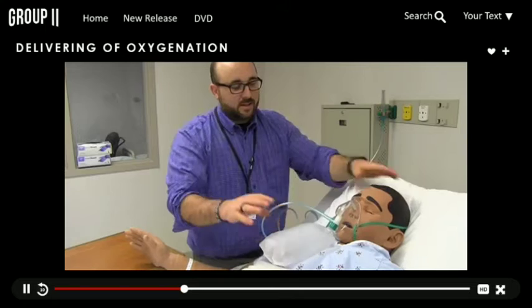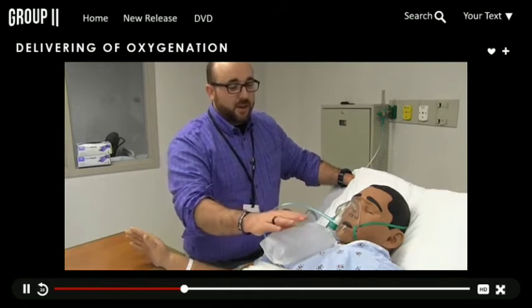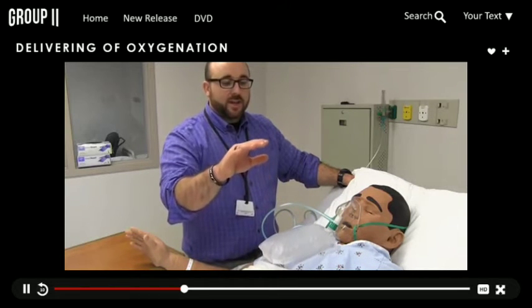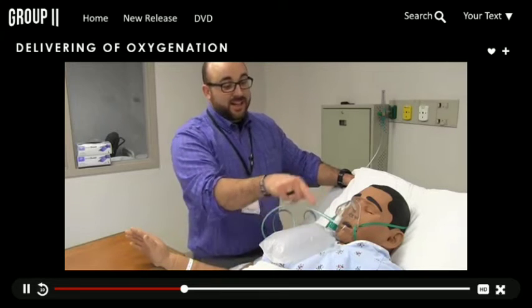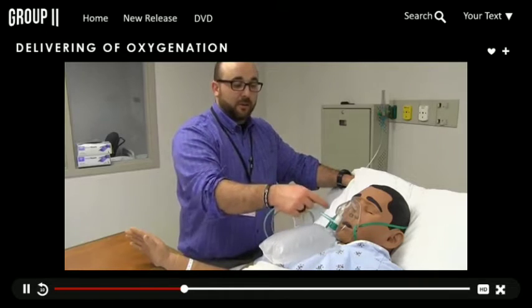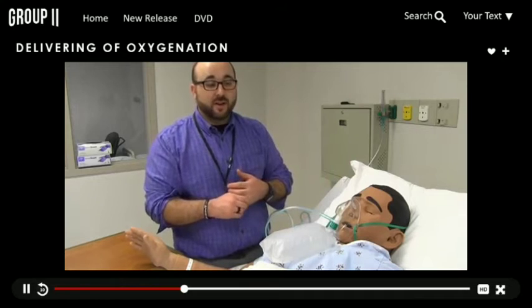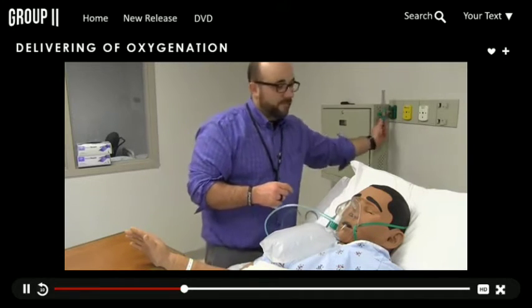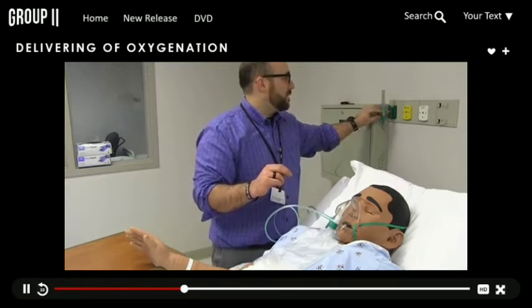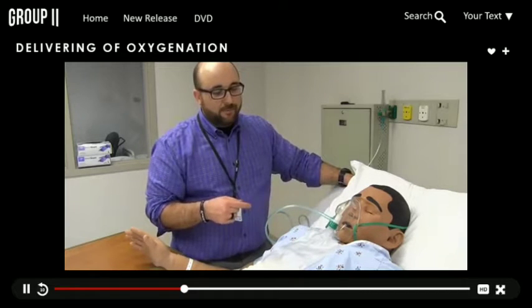And you'll see the bag inflated like this, and this is what it should sound like. When they take their breath, you'll notice this bag will deflate a little bit, and then it will fill up while they're exhaling, not because they're exhaling into it, since it's a one-way valve, but because the oxygen from the flow meter will refill it. So each time they take a breath, it comes from this bag and delivers really close to 100% FiO2. Now, if you walk in the room and you see your patient on a non-rebreather, and this happens a lot unfortunately, and somebody just put on 3 liters and that bag is deflated, you'll know that something's up.